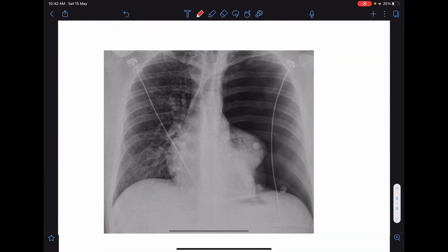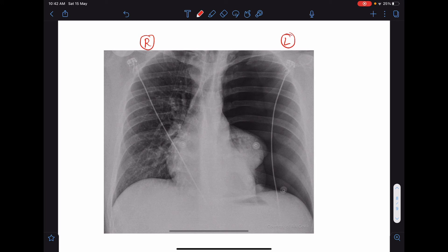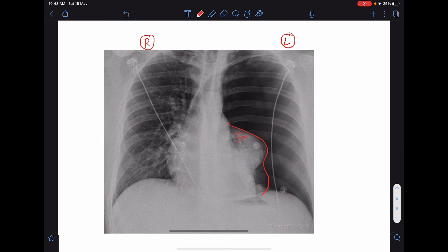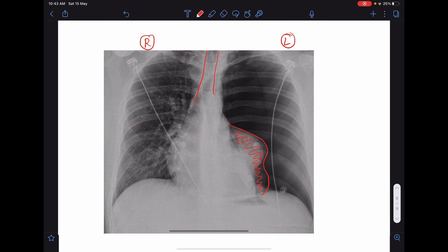Now, let's take a look at the chest x-ray. This is a real chest x-ray, PA view. This is the right lung field. This is the left lung field. If we look carefully, we can see that there is collapse of the left lung. This is the lung margin. Collapse will look white in chest x-ray because there is removal of the air from the lung tissue. So, this is the collapsed lung which is looking white. We have also said that the trachea will be pulled towards the side of the collapse, but in this particular chest x-ray, the trachea is rather pushed towards the opposite side.